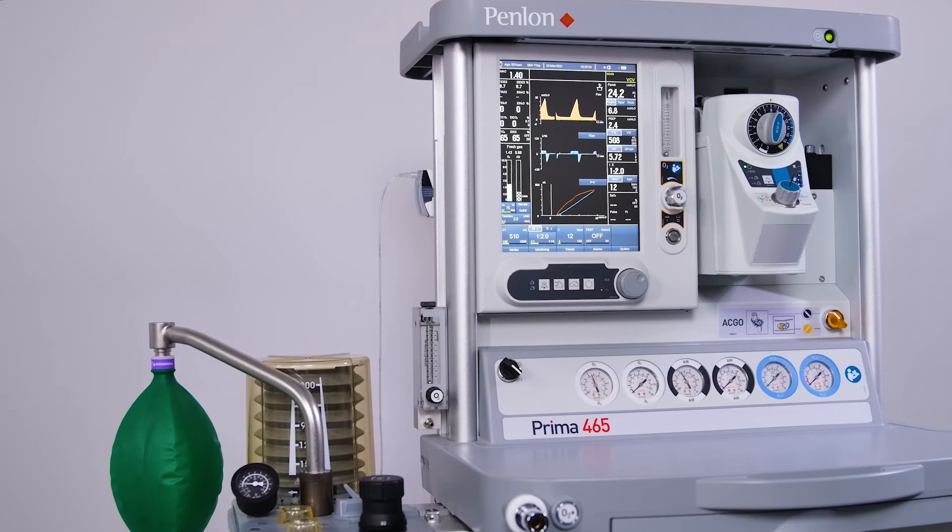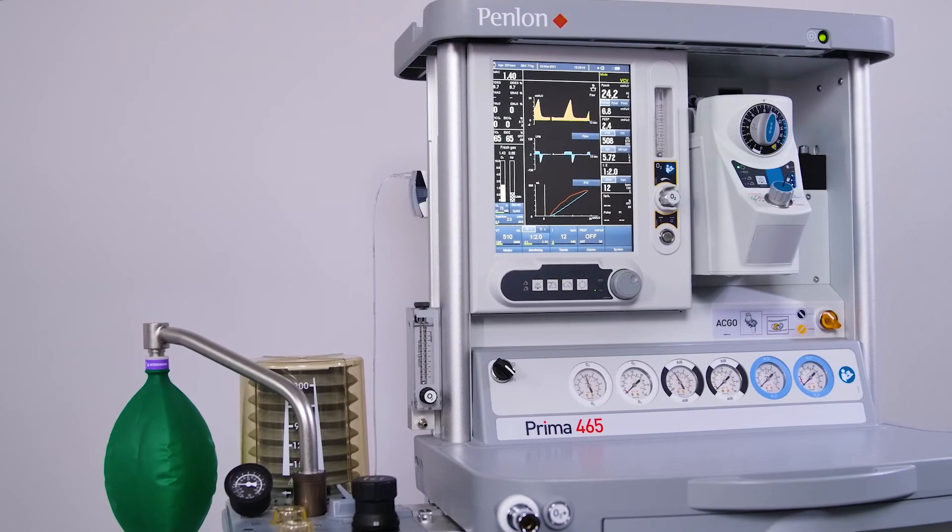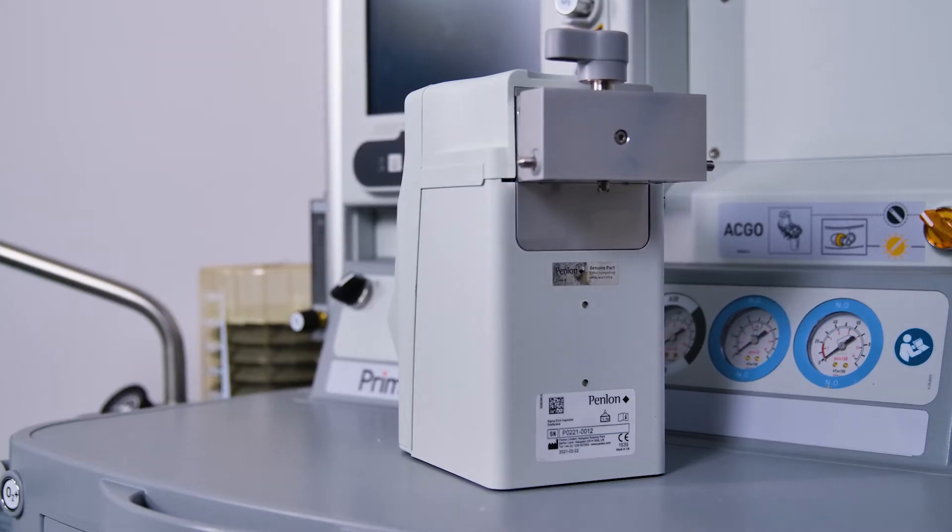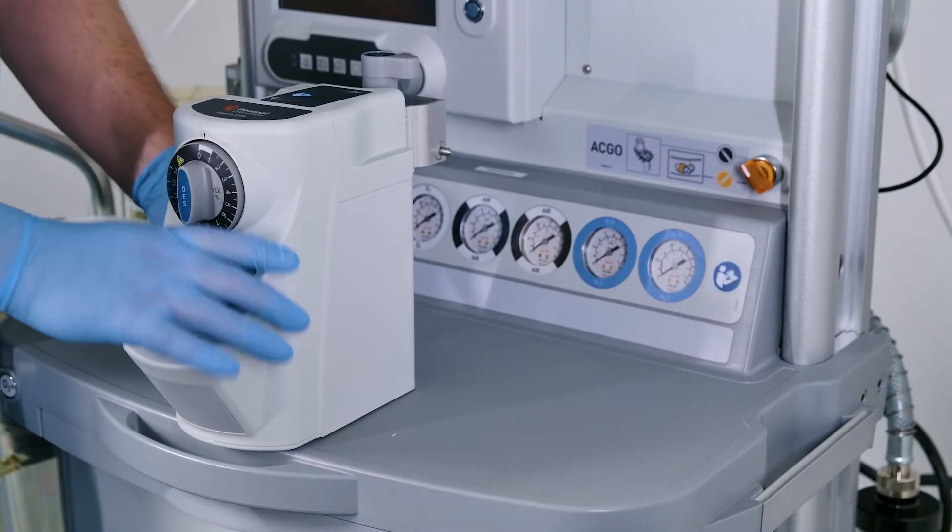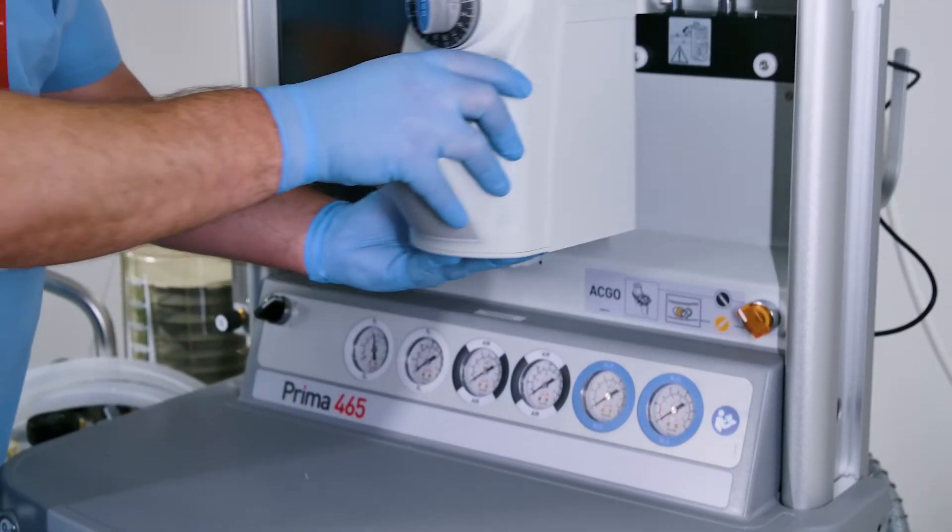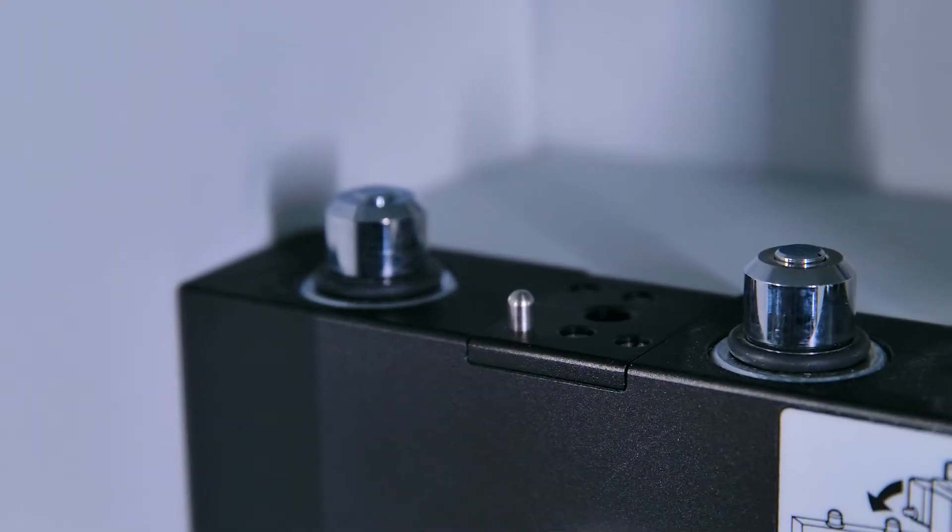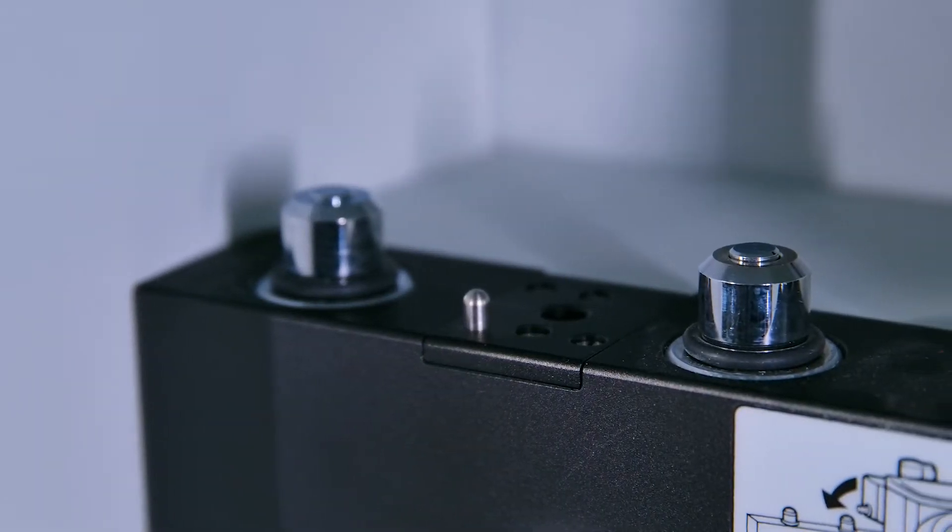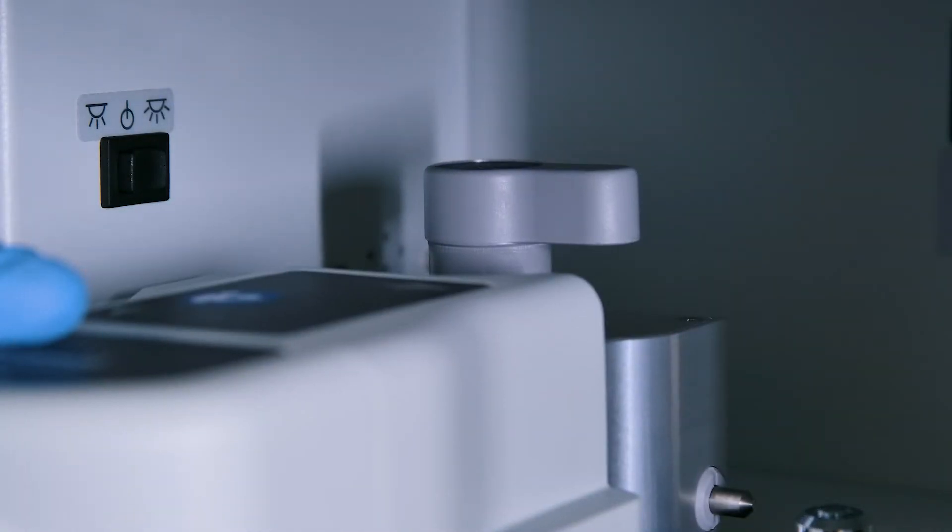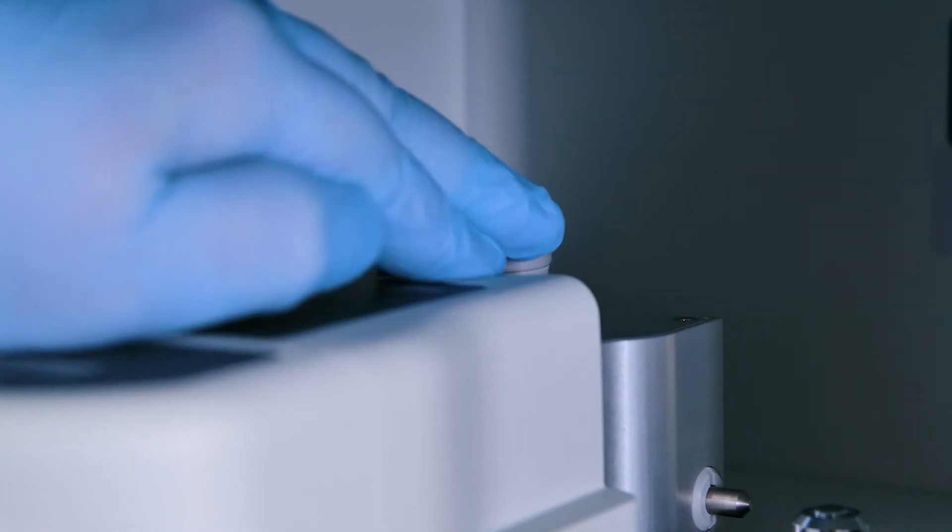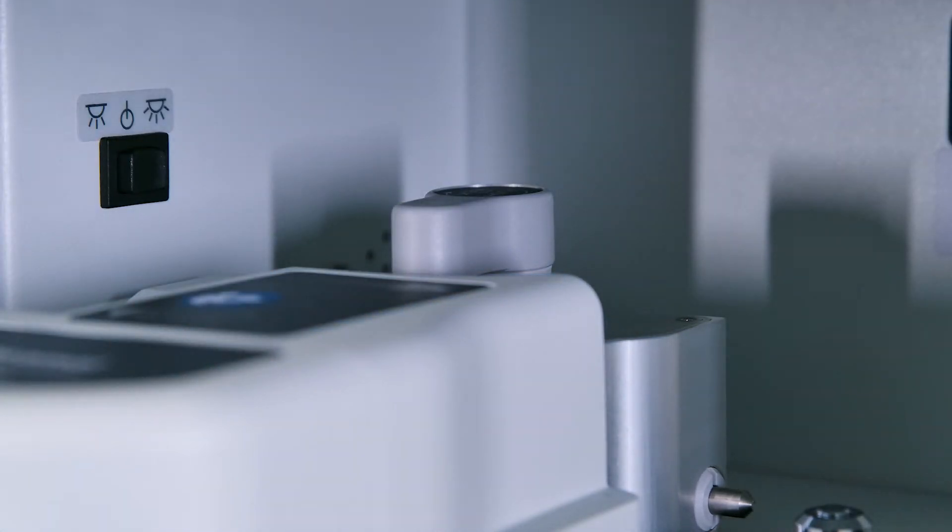Installing the Sigma EVA vaporizer on anesthetic machines with Selectatec or Draeger Auto Exclusion back bar manifolds. Offer the vaporizer up to the manifold. Align the gas connection ports on the underside of the connector block with the valve capsules on the manifold. Lower the vaporizer onto the manifold. Lock into position by pushing the locking lever downwards and rotating clockwise through 90 degrees.